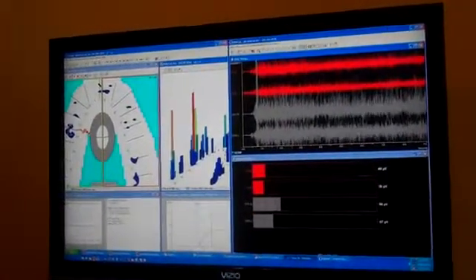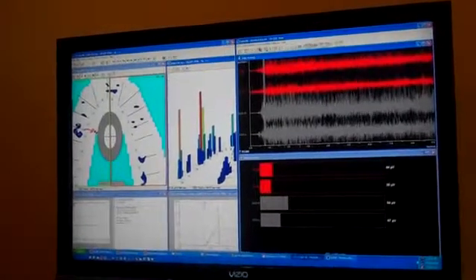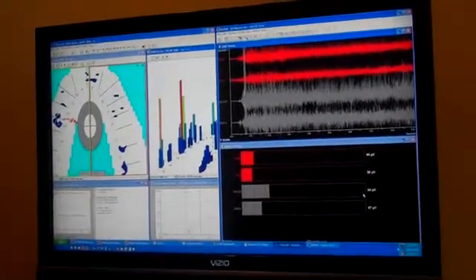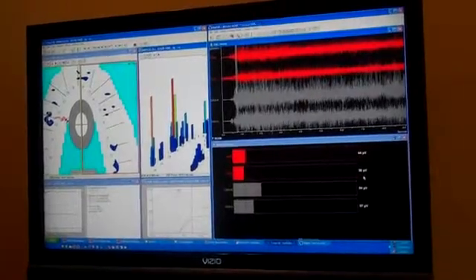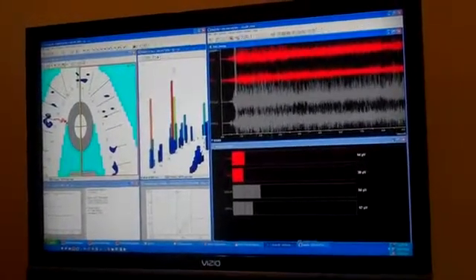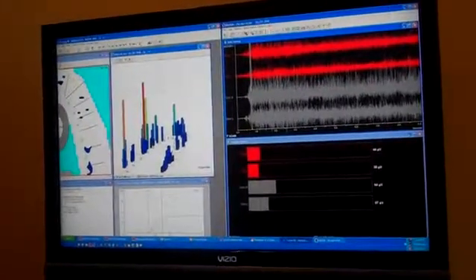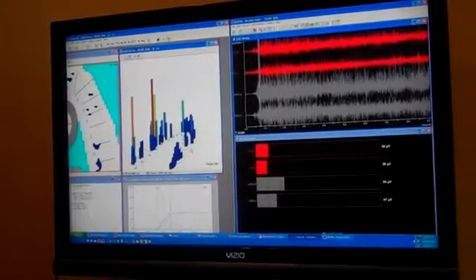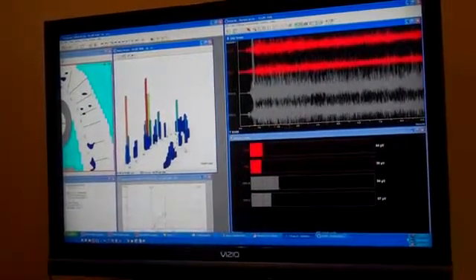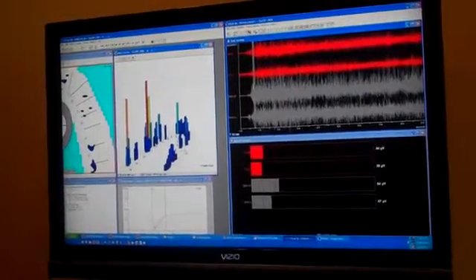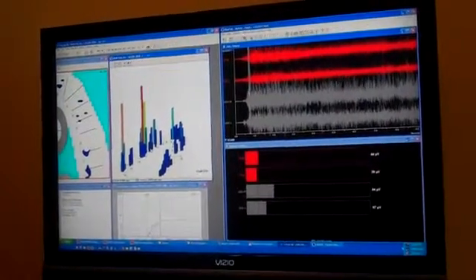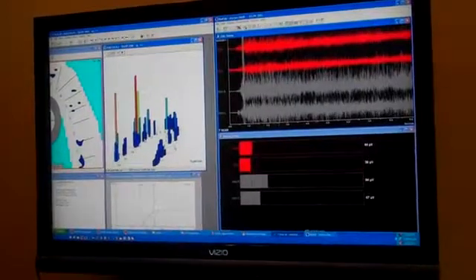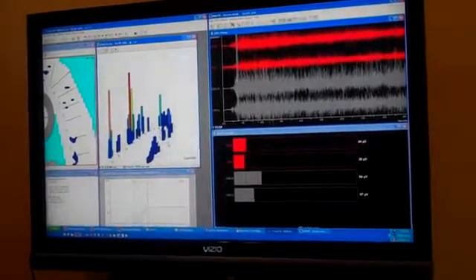We can gauge if certain muscles are overactive. This patient has headaches and a click and pop in the right joint. As we notice here, the right masseter muscle fires at twice that of the left side. But as we notice, the tooth contacts are normal, so we can't blame the patient's bite for this. It's her weakness in the joint that's causing the spasming of the right joint. This is the kind of precise detail you want to know before you start fixing teeth, joints, and muscles, so there's no guesswork involved before therapy.